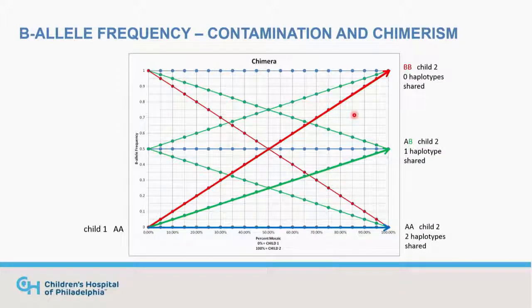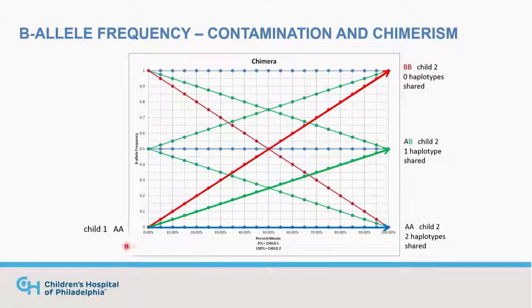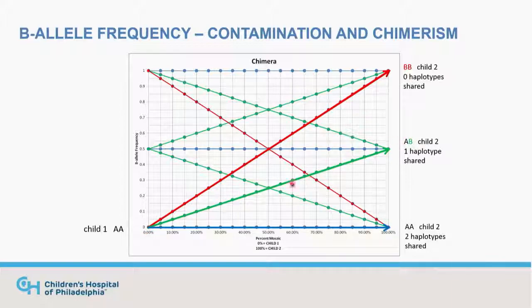When we talk about chimerism, we're mixing two people together. One individual's B-allele frequencies are at 0, 0.5, and 1 on one side, and a second individual's are on the other side. Based on the SNPs, we either have the same genotype in both persons (AA/AA — blue lines), one shared haplotype (AA/AB — green lines), or the most informative genotypes, in red, where one child is homozygous AA and the other is homozygous BB.